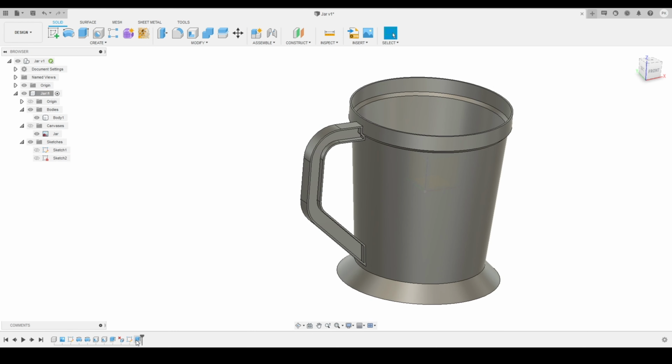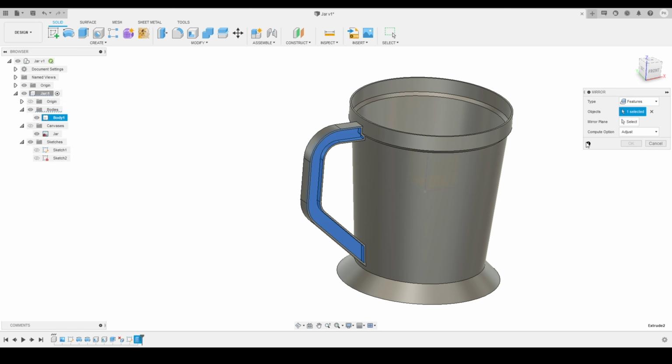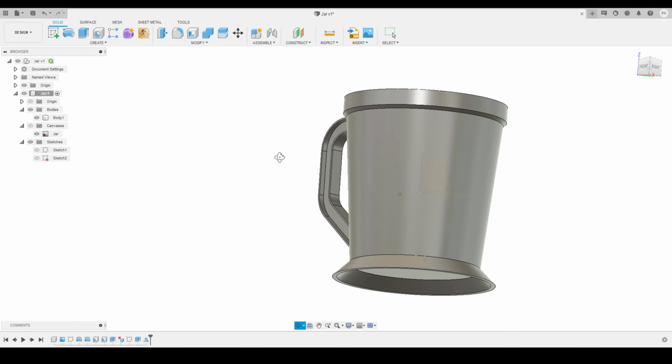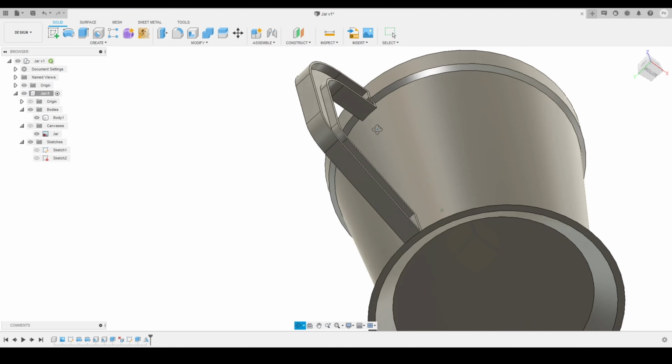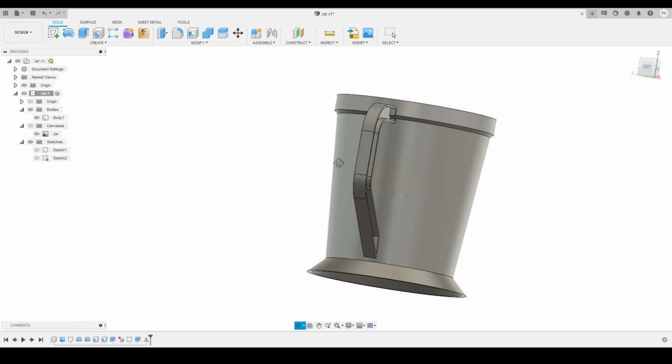And the next thing we'll do is select that particular feature and go to the create panel, activate the mirror tool, select this plane as the mirror plane, and press OK. So that feature is replicated on the other side of the handle as well. Here you can see this is the profile of the jar we got. It is looking very nice for now.